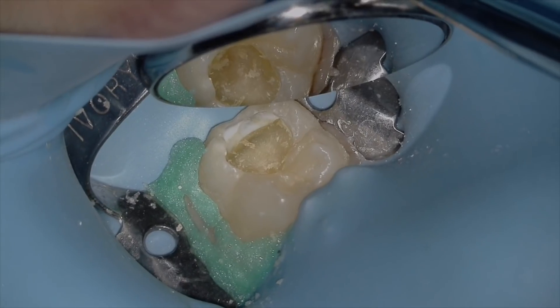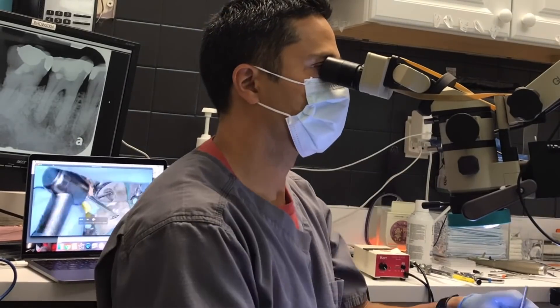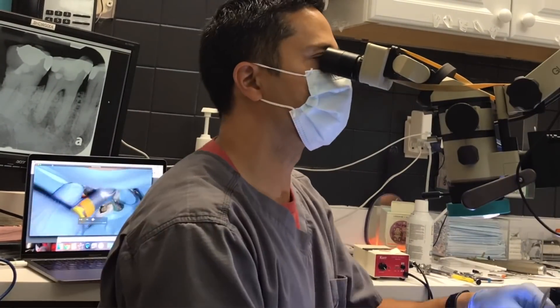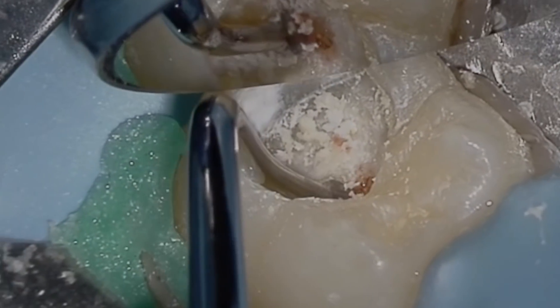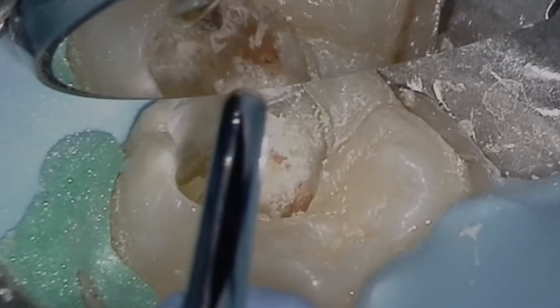I find that constant communication with the mother helped to relieve any of her fears. She's actually watching in real time the video feed from my microscope — she's pretty funny, so you might hear her cracking jokes and laughing. Once we remove most of the gross infected dentin, I'm going to remove the remaining infected and affected dentin with a spoon excavator. We're expecting to hit a pulp horn, so I'm planning on that, and so is everyone in the room.